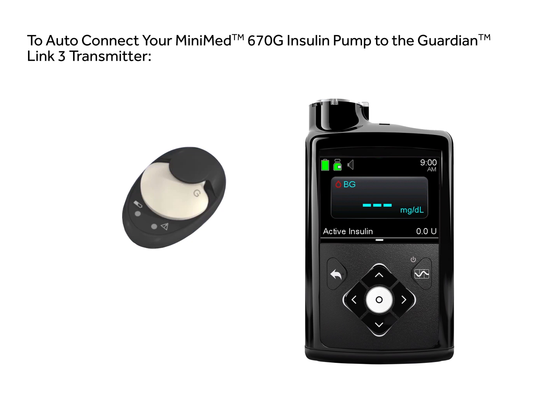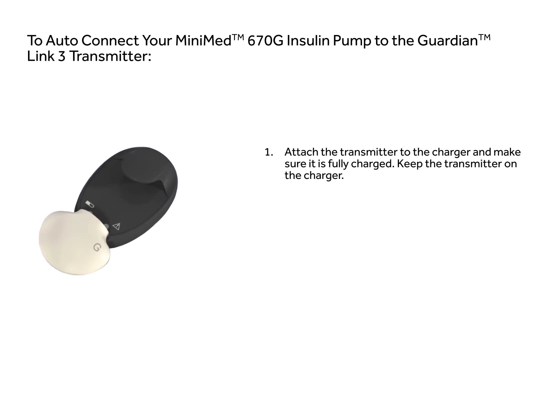This video will show you how to automatically connect your MiniMed 670G insulin pump to a Guardian Link 3 transmitter. Attach the Guardian Link 3 transmitter to the charger and make sure the transmitter is fully charged. Keep the transmitter on the charger.